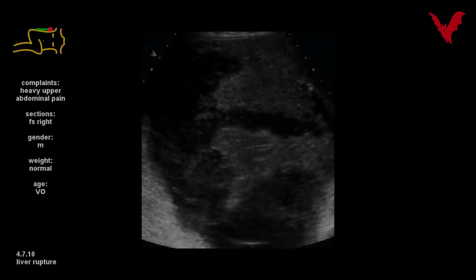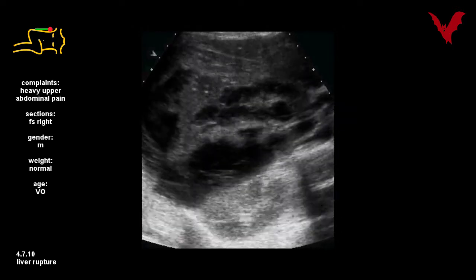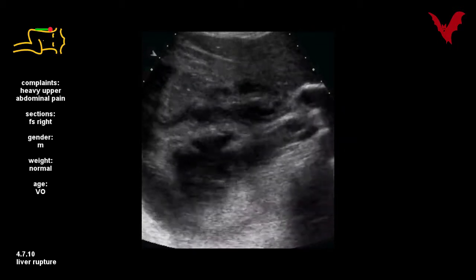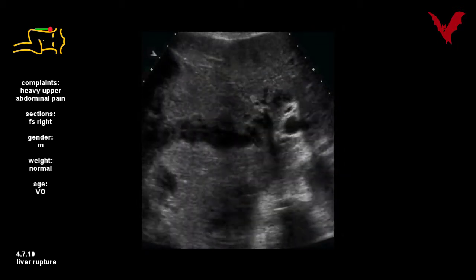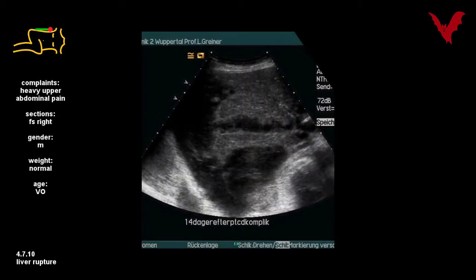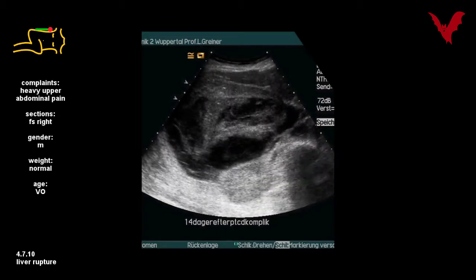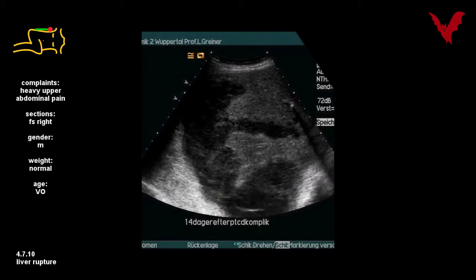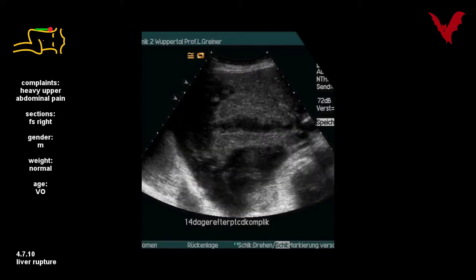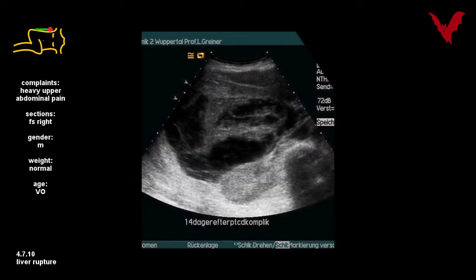This rare complication of liver rupture in 4.7.10 happened due to uncontrolled inspiration in an elderly lady during successful PTCD placement — percutaneous transhepatic cholangio-drainage. After two months, the lady could be discharged.